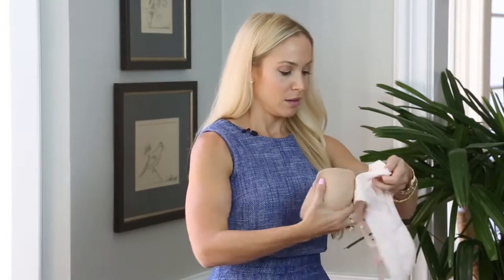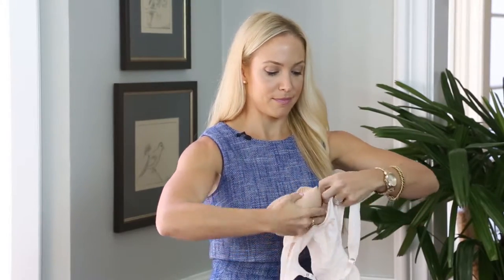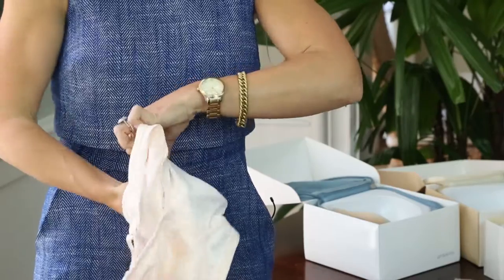Let me show you how easy it is to put the breast form into a pocket of a bra. Go ahead and locate the opening of the pocket, gently cup the breast form, and it slides right in.